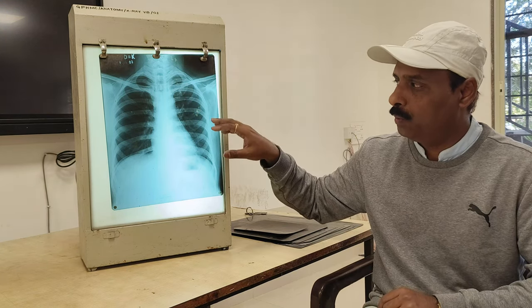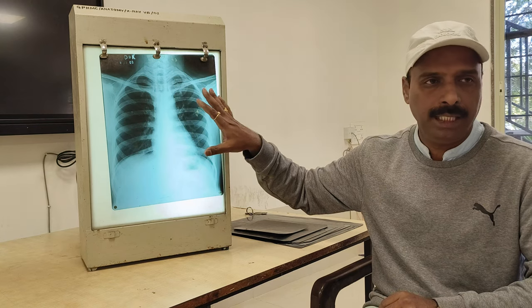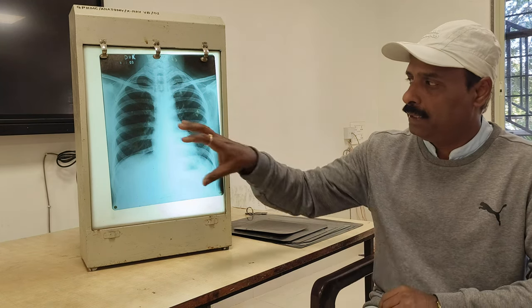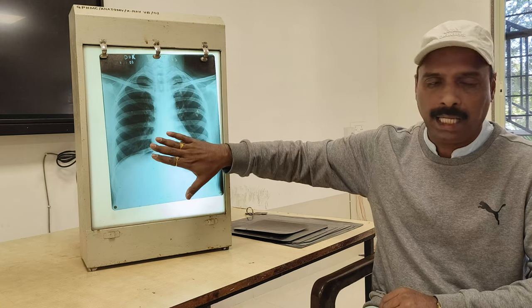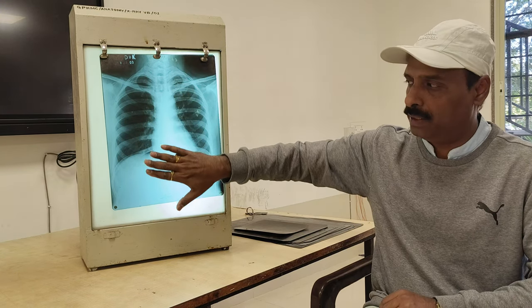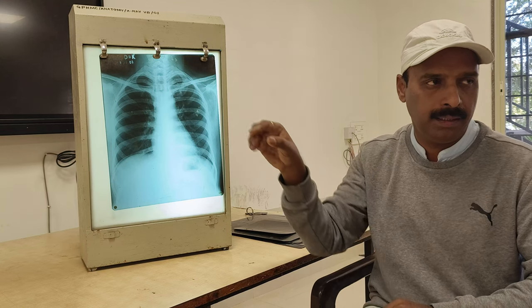You have to see the plain x-ray of chest, which we call a PA chest. You have to remember how we take the x-ray in the PA chest. The patient is made to face the film side, and the x-rays are passed from behind. The person is standing and the film is there, and the rays pass from behind to front. That is what we call the PA, posterior anterior aspect of the x-ray.